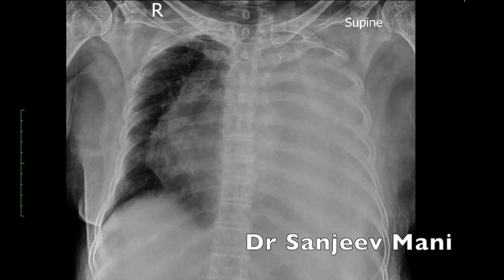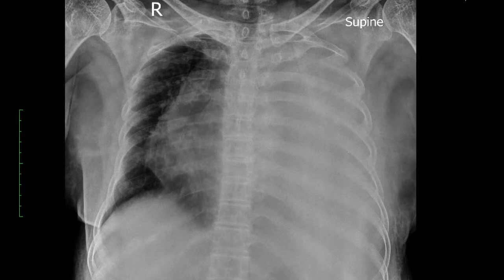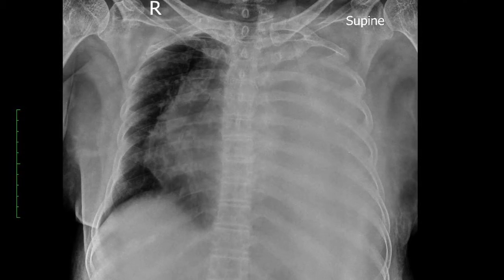This is a chest X-ray AP view of an elderly woman taken in the ICU. What we see here is a complete white-out or a completely opaque left hemithorax. What is important to note here is that there is cardiomediastinal shift.